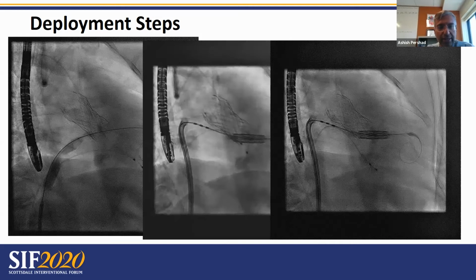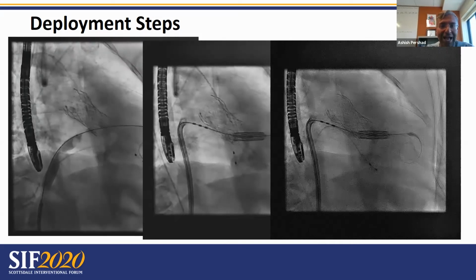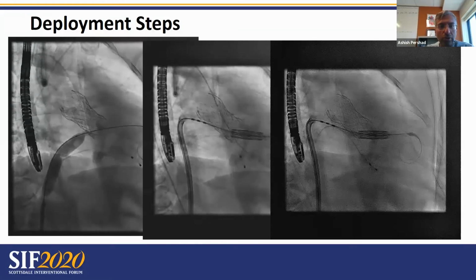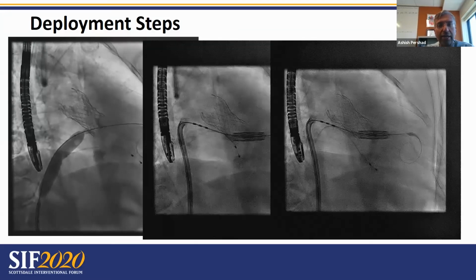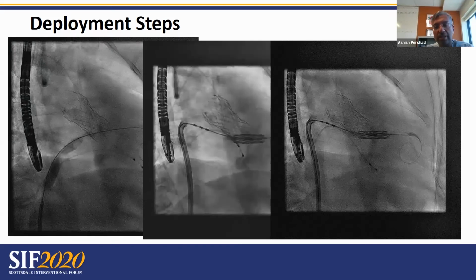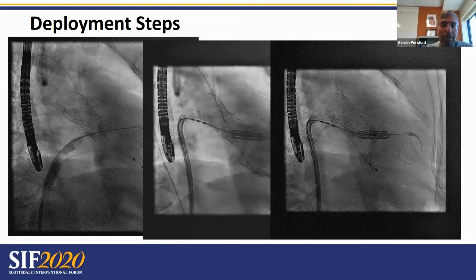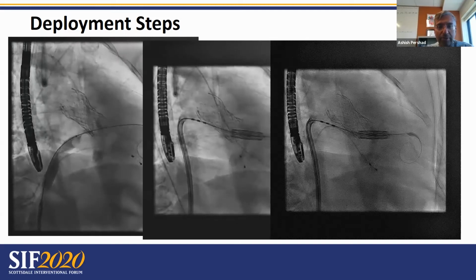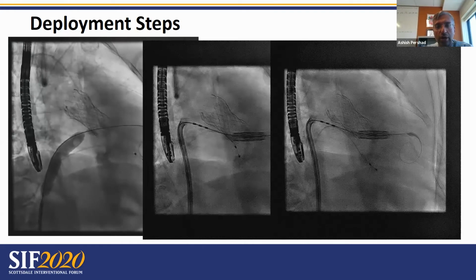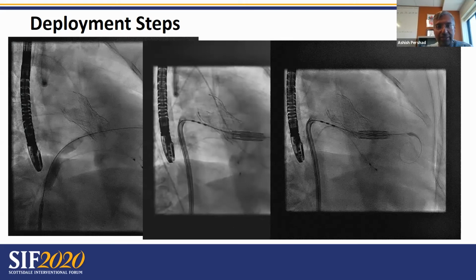And we advance the valve with the Edwards logo pointing down. Once we've gotten that orientation, we are then able to safely advance the Edwards sheath across the septum. It's really important to dilate the septum and floss it adequately, because the one thing you don't want is your valve, once it's loaded, getting caught in the septum, because that would make for a very long day.